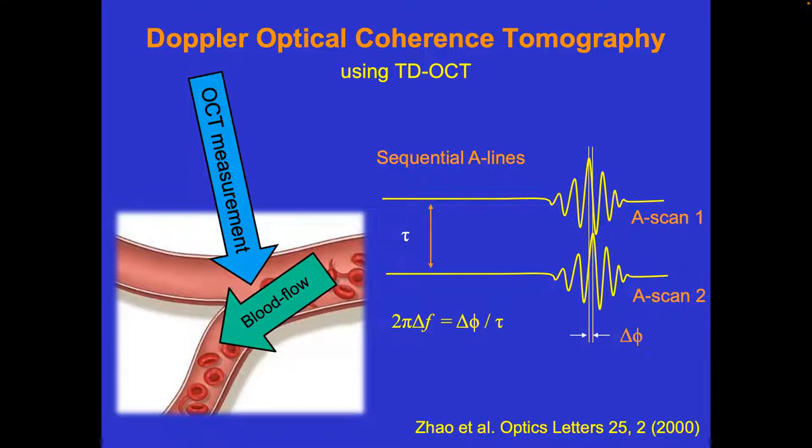But when I show you this picture, I do one measurement, then I delay and do my second measurement, I can very intuitively explain to you that there will be a phase shift. You can use the signal because of the motion. Oh, you have a hard time already with the phase shift. Yeah, I'm really thinking about how this would work in practice. You start with your object, and then you move the object by 10 nanometers.